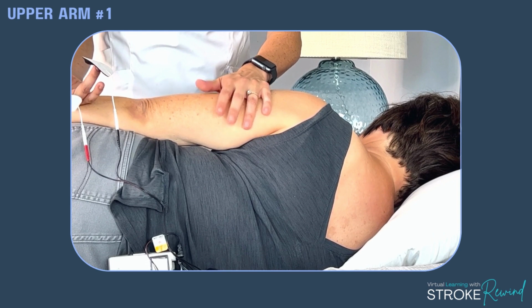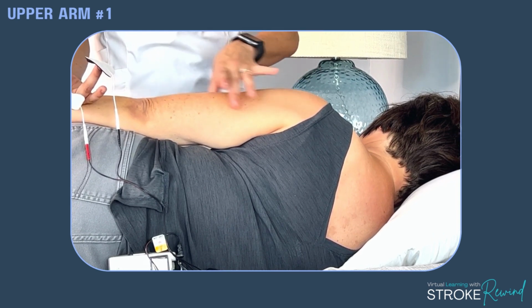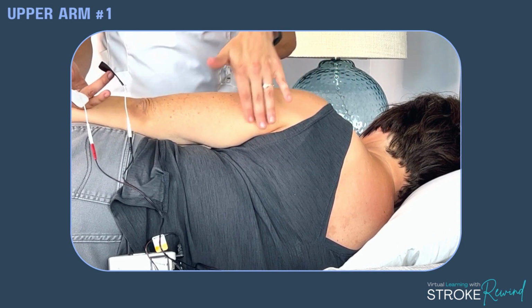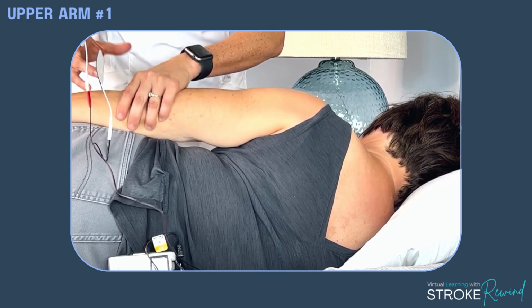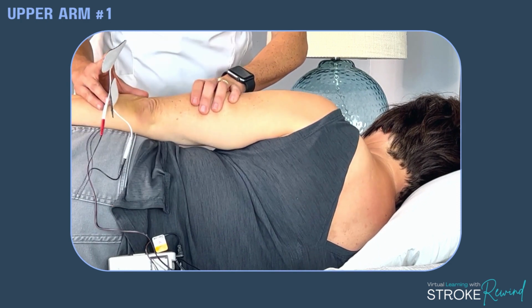So let's move on to the upper arm, and there's 2 placements for the upper arm. So I'm talking about the area between the elbow and the shoulder that I would recommend putting the electrodes. One is the back of the arm, and this muscle back here is called your tricep, and the other is going to be for the front of the arm or your bicep. So let's start with tricep.